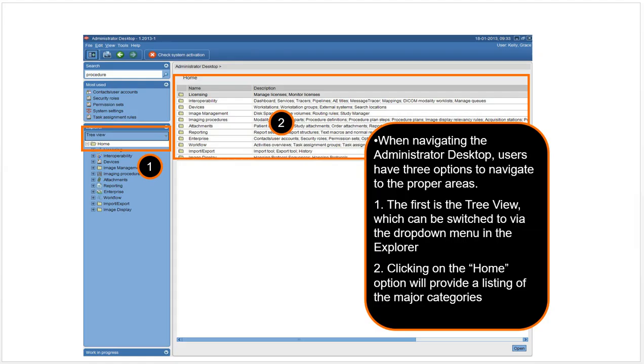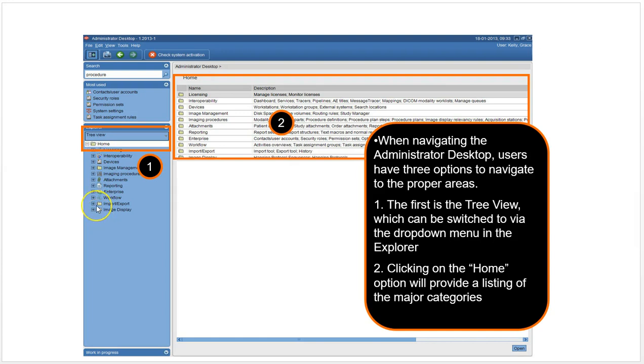This is the administrator desktop. This is where the PACS admins go. Here you basically have two ways of looking at data. You've got the tree view, and you can expand on these pluses to go into different things. If you are interested in something, a problem with the reporting desktop, you might want to expand the reporting area here.